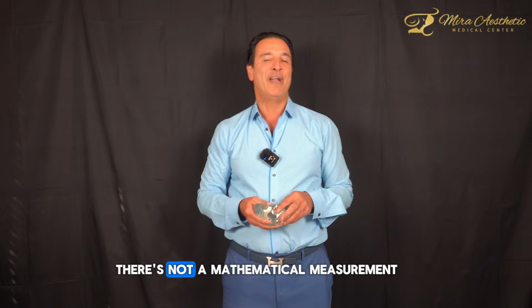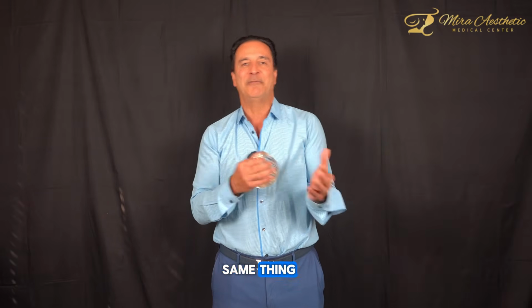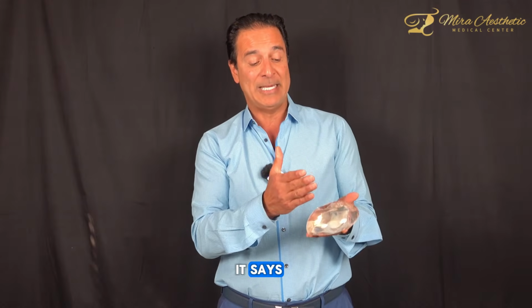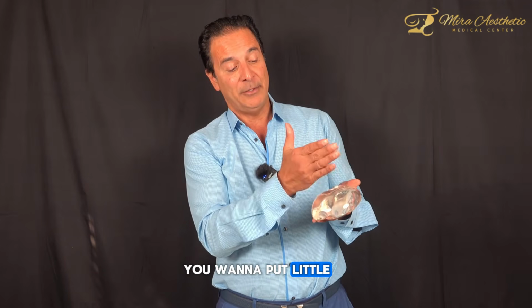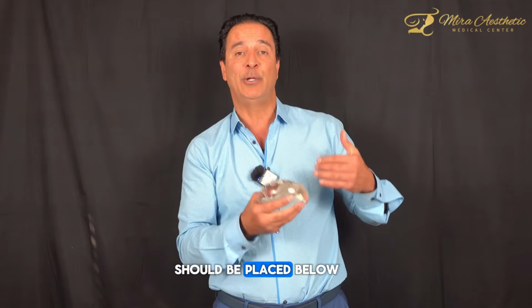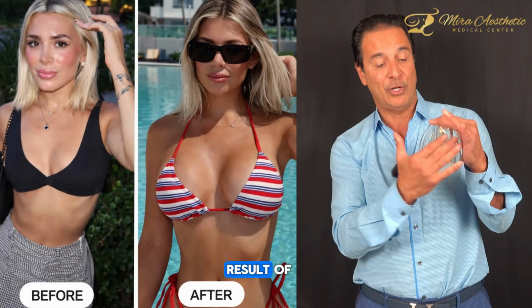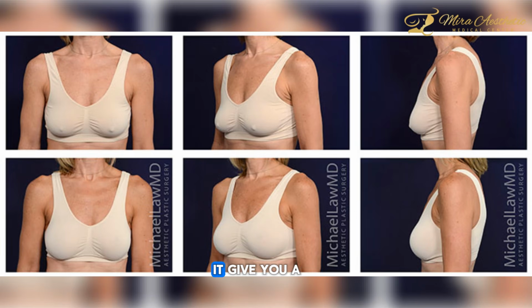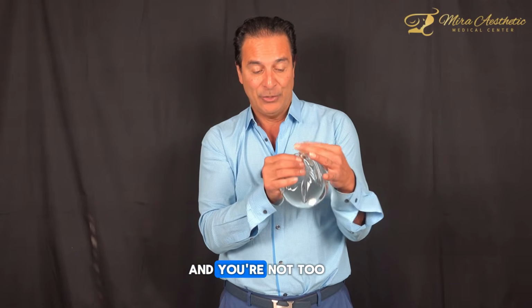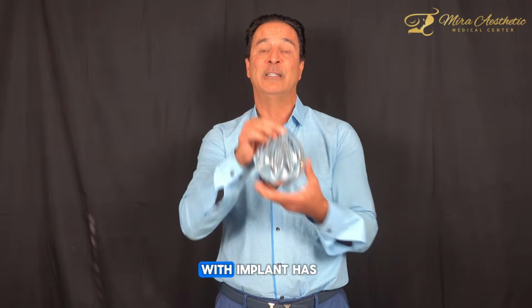Obviously there's no mathematical measurement we can actually do, but it's the same idea, 55-45 or 60-40. Basically, you want a little bit more than half of the implant placed below the nipple areolar complex, which, when you're standing up, gives you a little bit fuller breast on the bottom, and you're not too top heavy. So you have the natural curve that an implant has.